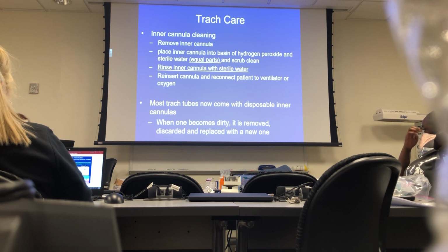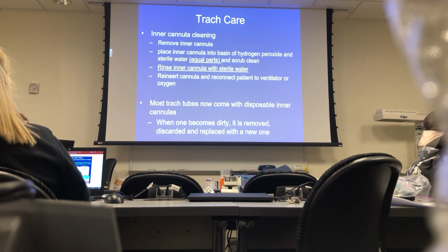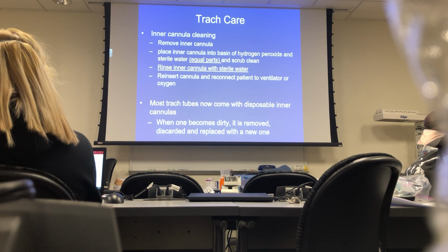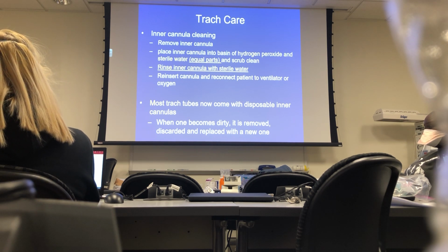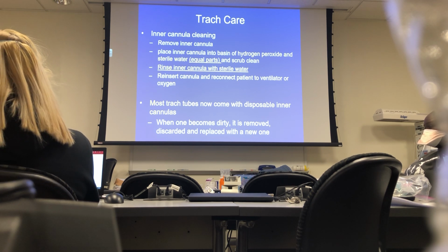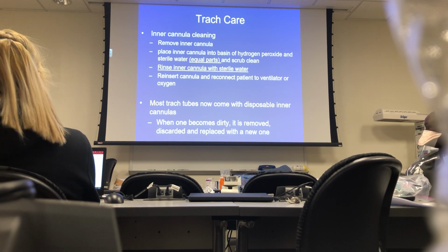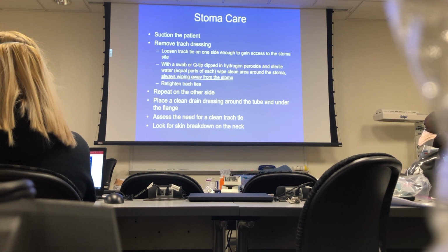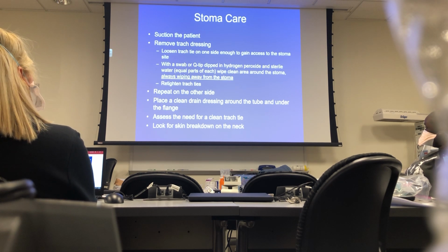And then you put in, if you have to, new trach sponge or trach ties, okay, to keep everything clean. So never wipe back and forth, and the boards will ask you, what's the percentage solution? It's hydrogen peroxide 50%, sterile water 50%. All right, stoma care, I just talked about that with the Q-tip, okay?